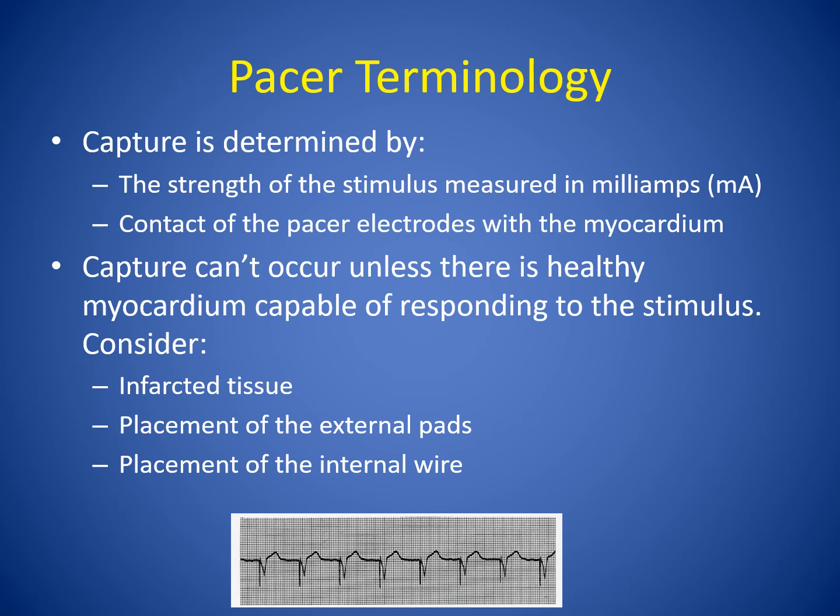There was a case scenario there once in a code. The ICU nurse thought they were doing something wrong with the transcutaneous pacer as they could not get it to capture. And checking everything, they had it all right. The milliamps were increased to the max, which is 140 on an external pacer. It did not get capture.